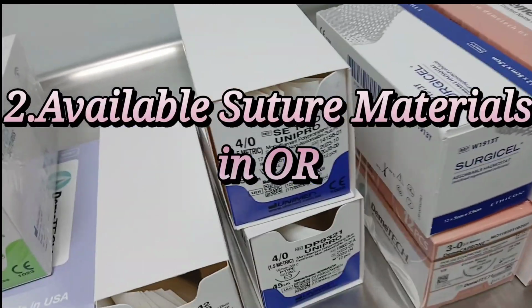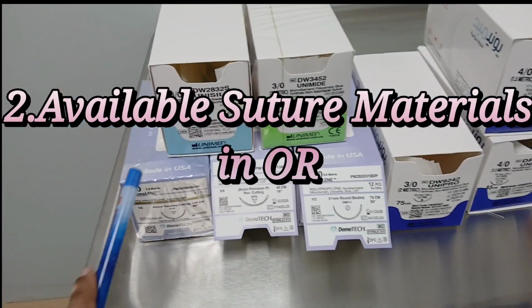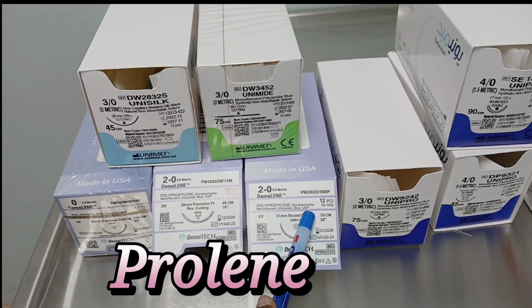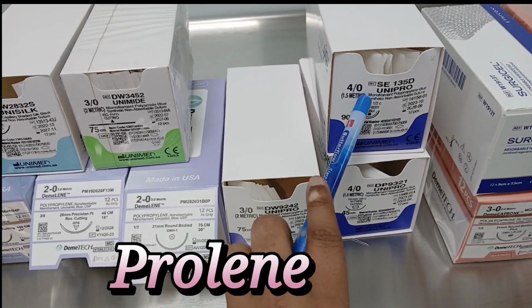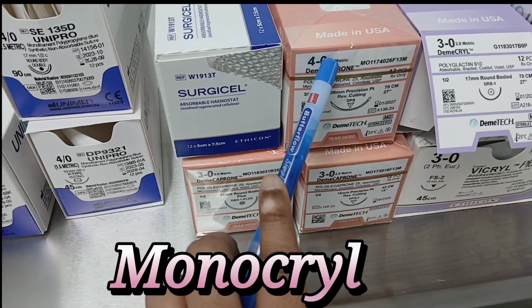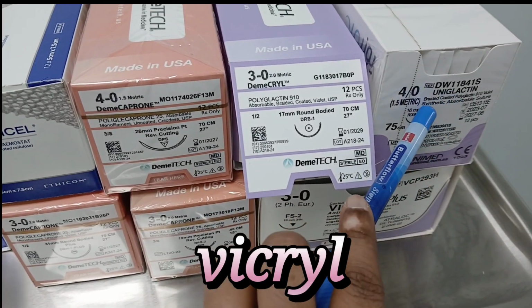Then we will go to the available suture material now. What kind of suture I am arranging here, that I will explain. This one is silk, ethilon, prolene 0, prolene 2-0, prolene 3-0, prolene 4-0. Surgicel, monocryl 3-0, monocryl 4-0 and vicryl 3-0, vicryl 4-0.